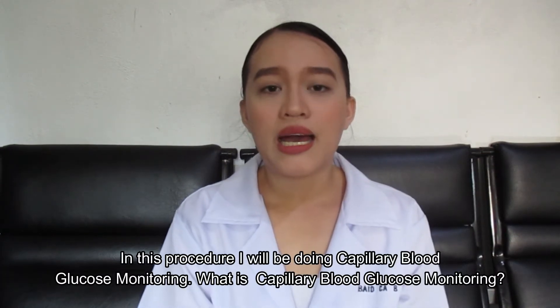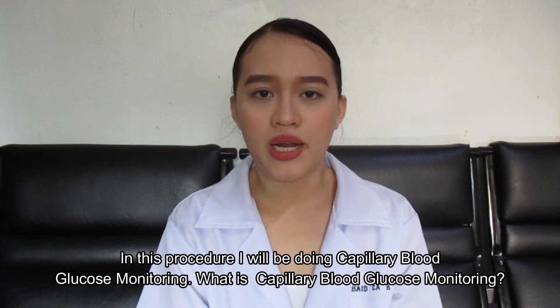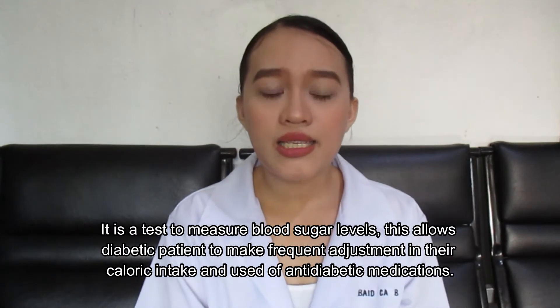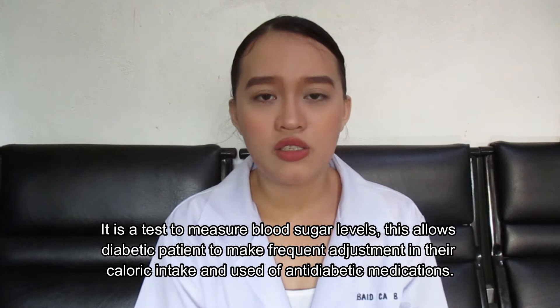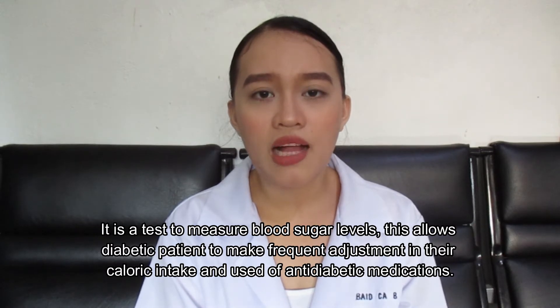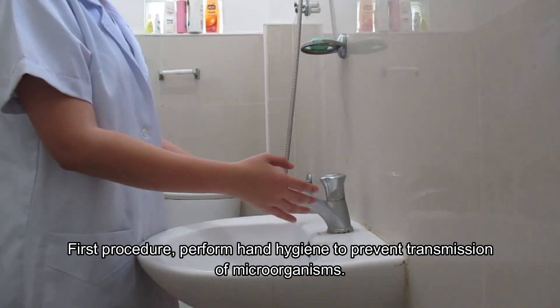In this procedure, I will be doing capillary blood glucose monitoring. What is capillary blood glucose monitoring? It is a test to measure blood sugar levels. This allows diabetic patients to make frequent adjustments in their caloric intake and use of anti-diabetic medications.